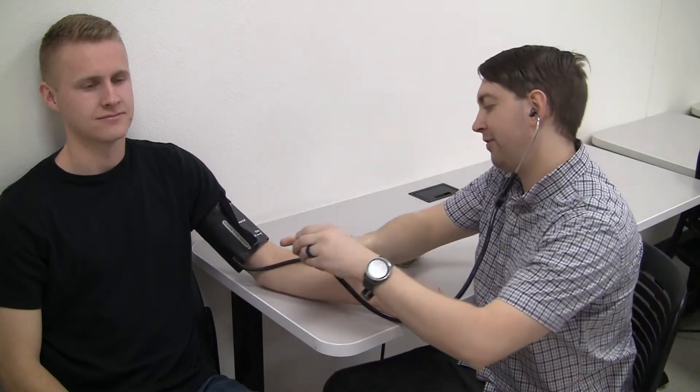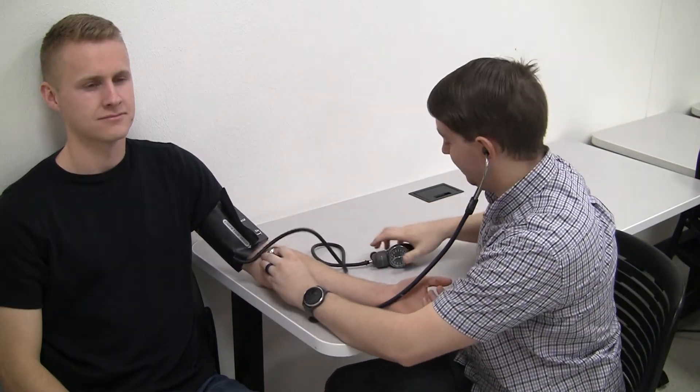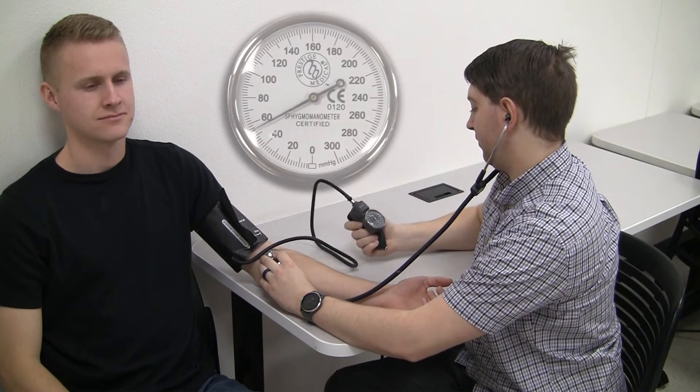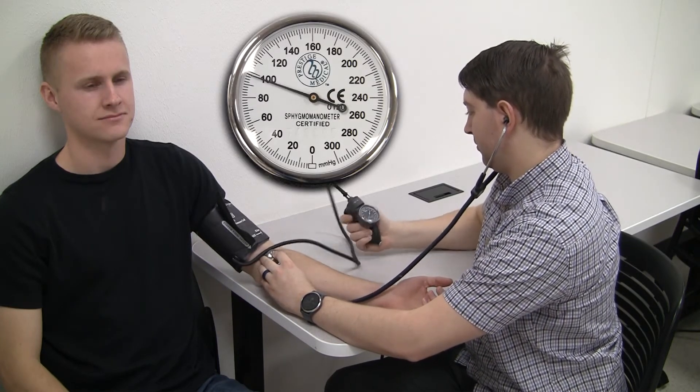After we've let the patient's arm rest about 30 seconds, it's time to use our stethoscope. We'll place it in the pit of the elbow, just distal to the cuff.